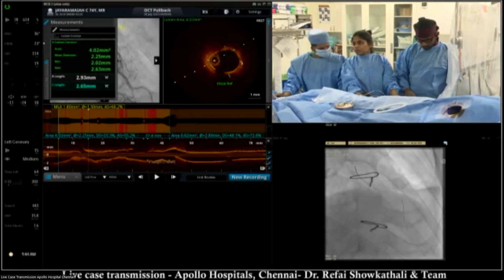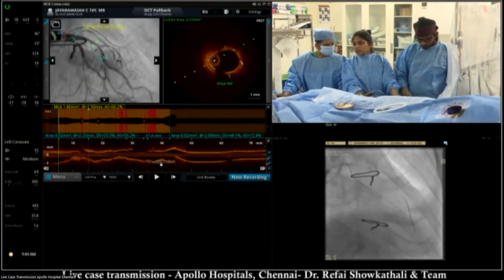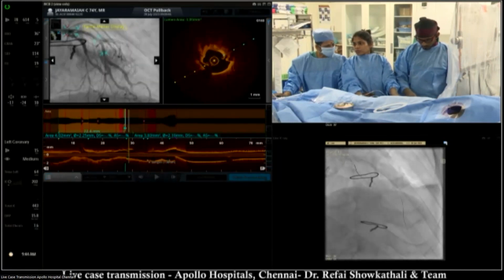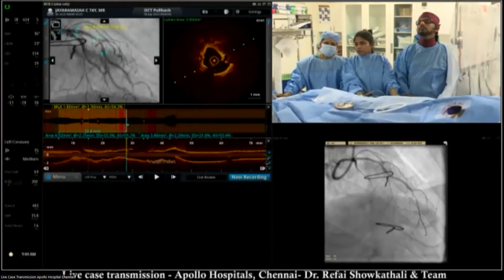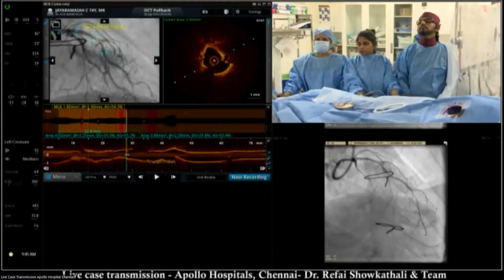He used a one-to-one balloon. He showed the post-balloon OCT. And no ablation strategy, no rotablator, nothing. So it doesn't need anything beyond a 1:1 balloon followed by a stent. Yes, okay. Because atherectomy is not required, sir. Not required. Not every calcified lesion requires a rotablator. Of course not.